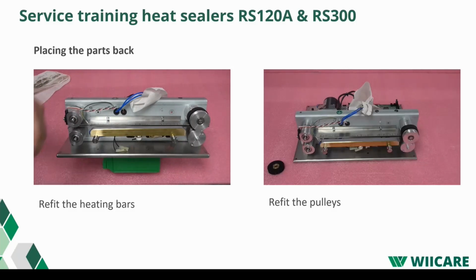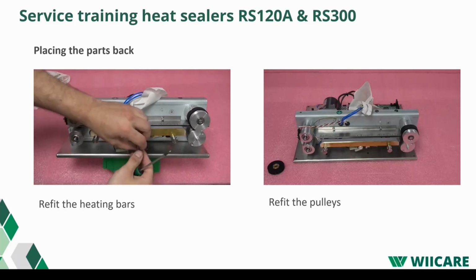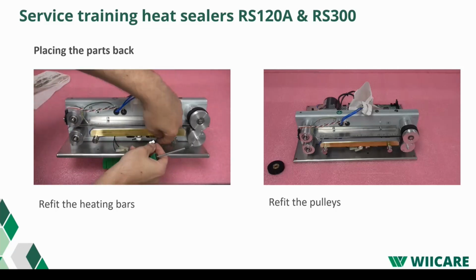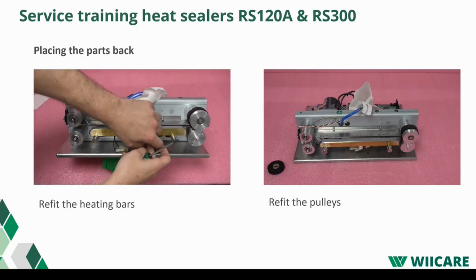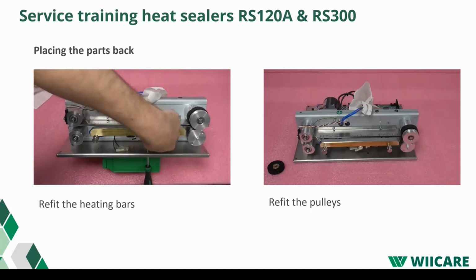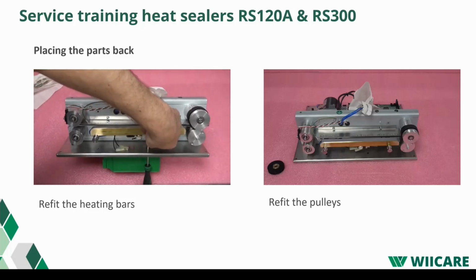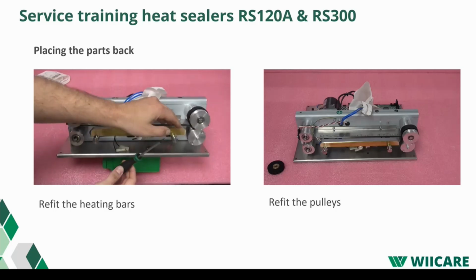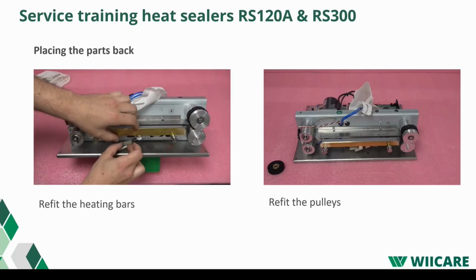Screw the thermocouple back on. Also put on some copper paste. You can see the aluminium part, which is on top of the actual thermocouple. It's used to do the calibration later on. It comes with every machine. It's one snap. And reconnect the cables of the Clixon.